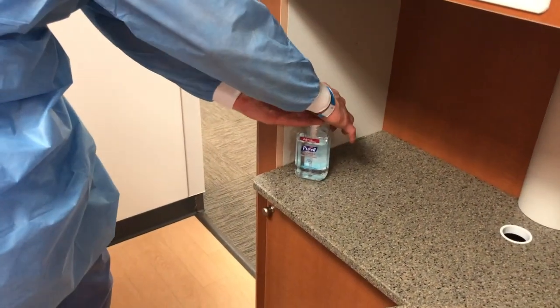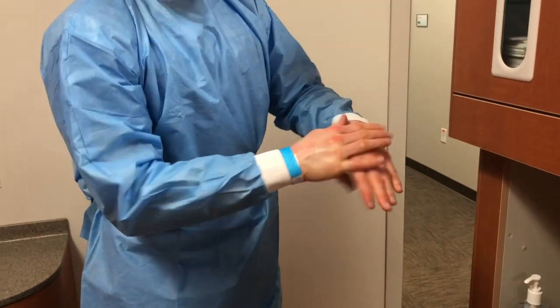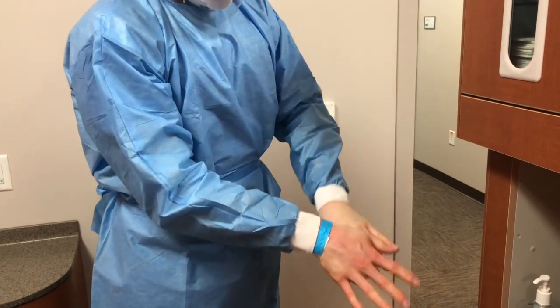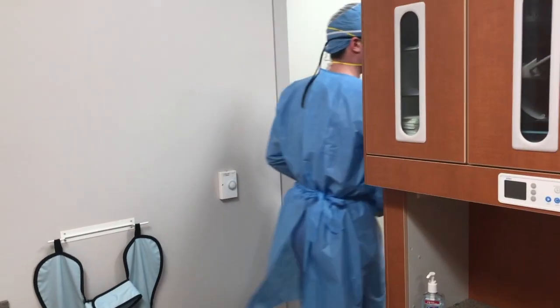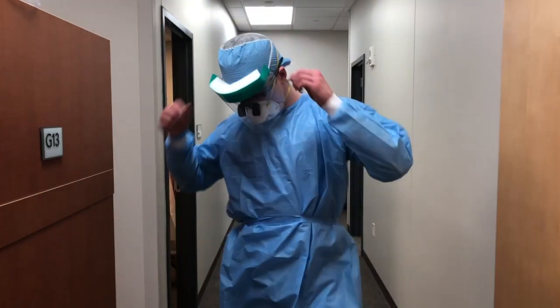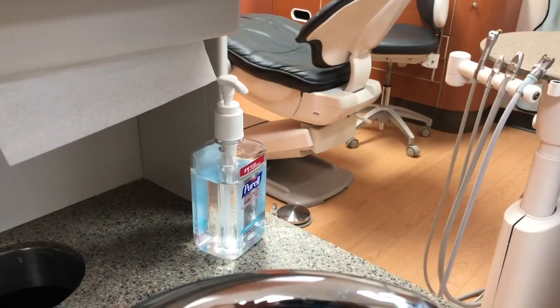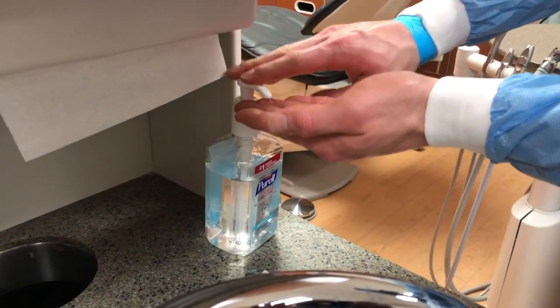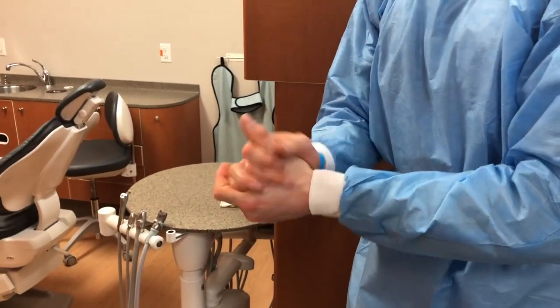Perform hand hygiene before leaving the treatment area. The next item to remove is the face shield — grab the strap at the back and pull it off the front of the face without touching the shield. Discard the shield and perform hand hygiene.